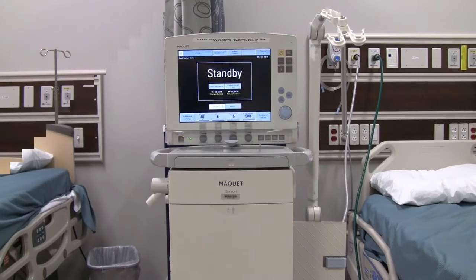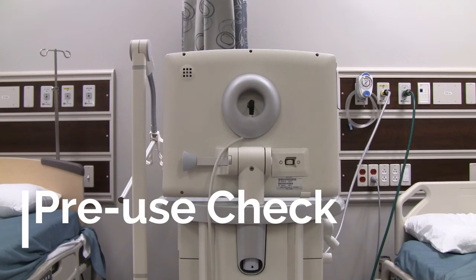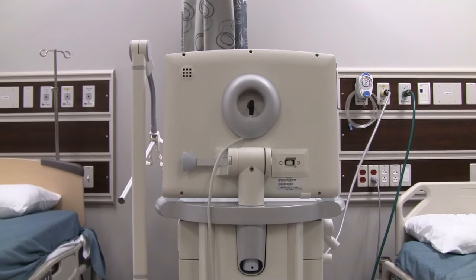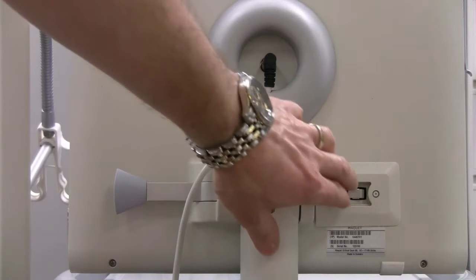Next we will start our pre-use check. I have already plugged our gas sources into the wall and plugged our power into a red outlet to ensure backup power. So now we need to turn on the ventilator. Looking at the back of the user interface, there is a power switch on the bottom right-hand side. We will flip that on.